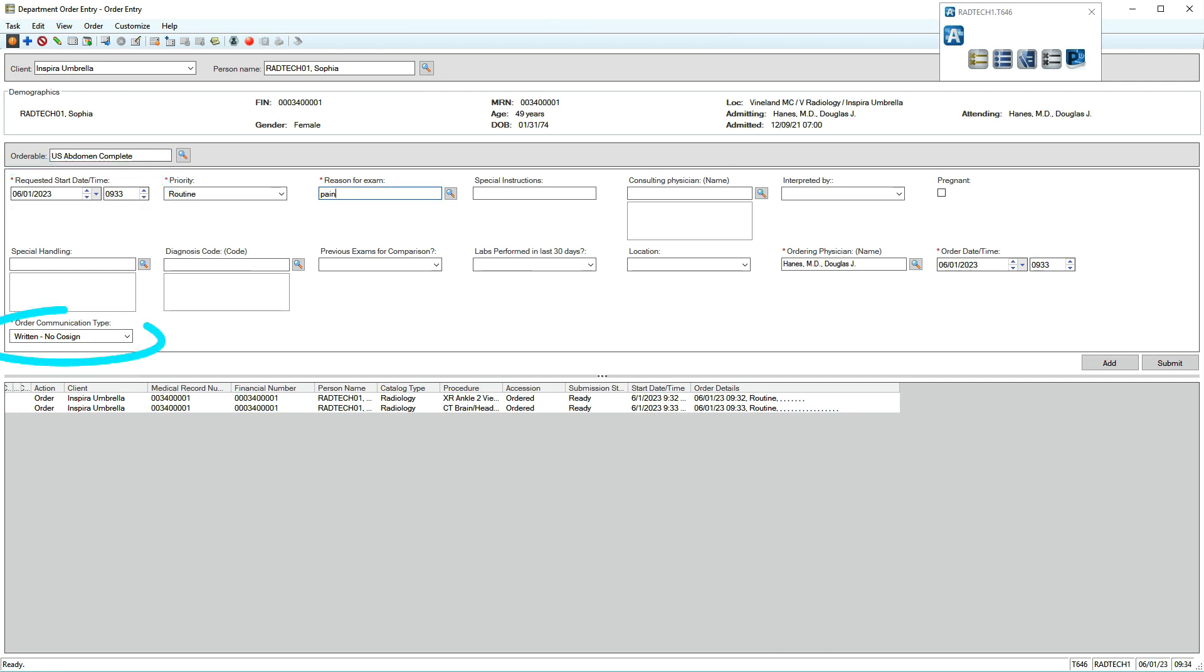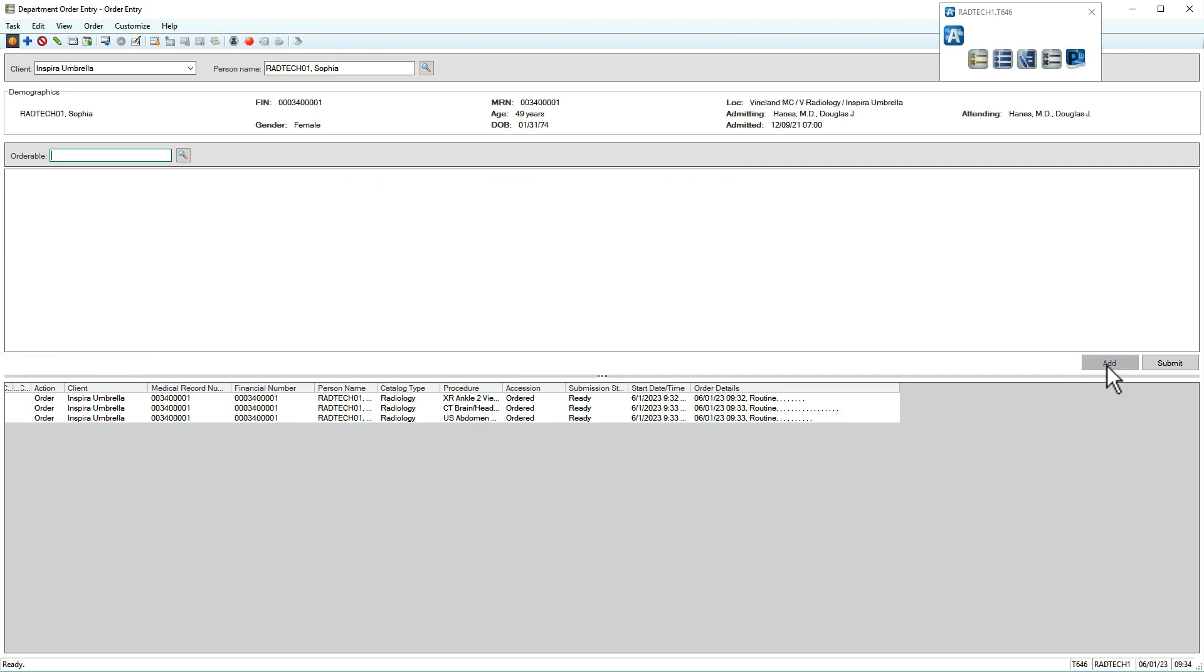Communication type indicates whether the ordering physician will receive a request for co-signature. When you're finished adding orders, click Submit.